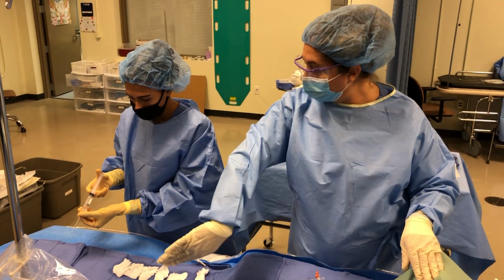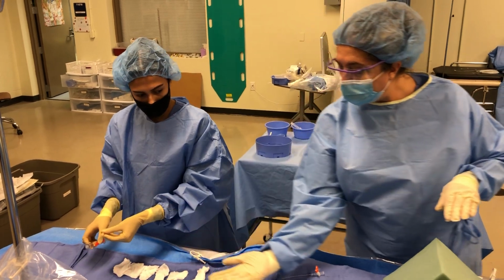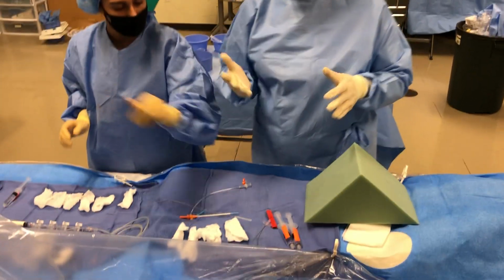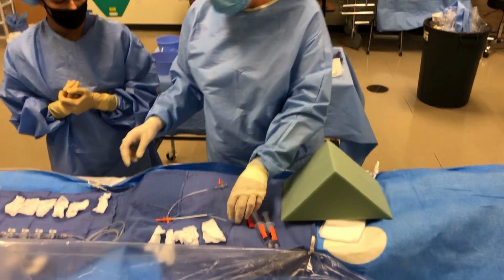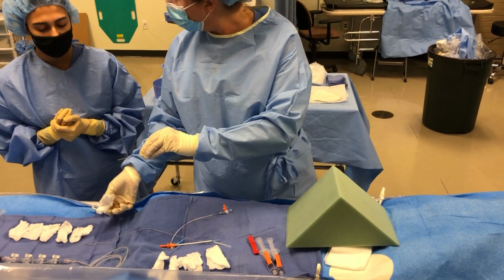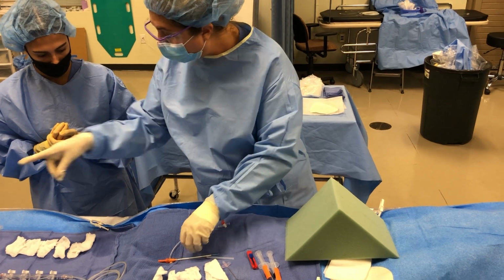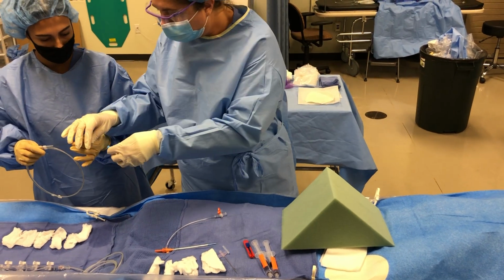Make sure you're flushing, pointing away, just like she's doing. Good. Bring the needle in, away. Oh, okay. Yep, good. So that I don't accidentally hit, and you can lay it down. And I usually say, okay, coming in with the needle. And then the doctor can pick it up. Some people, if there's visible blood on the hub, you could do a little wipe as well with your wet 4x4. Okay? So we're gonna demonstrate, go ahead and grab the long wire.